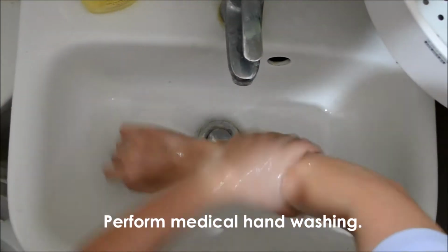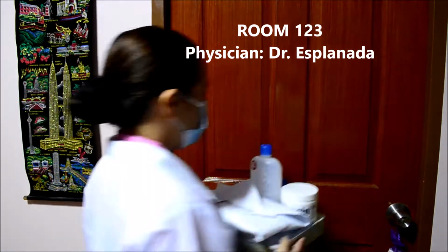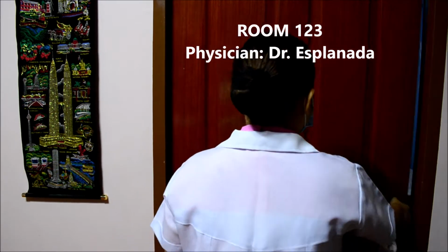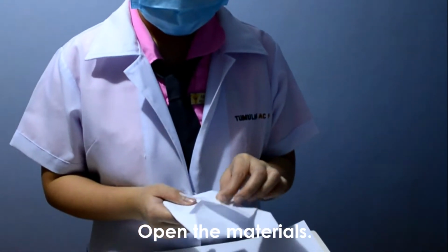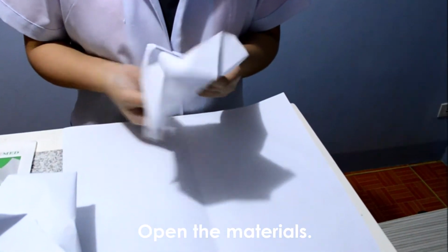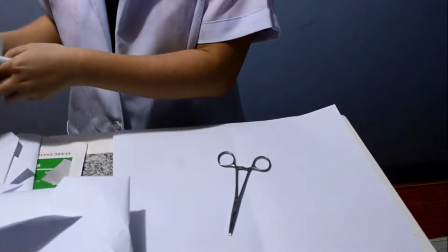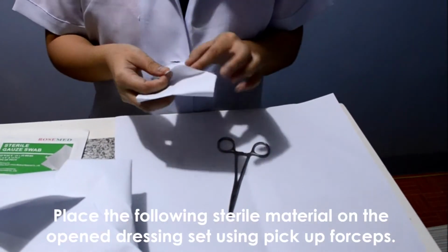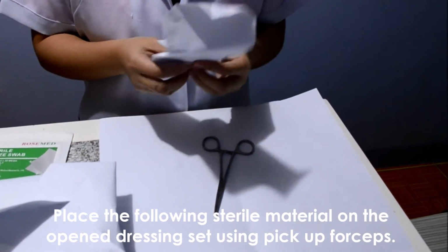Perform medical hand washing to prevent cross contamination. Bring the tray with all the materials to the patient's bedside. Open the materials in the patient's bedside and place the following sterile materials on the open dressing set using the pick-up forceps.